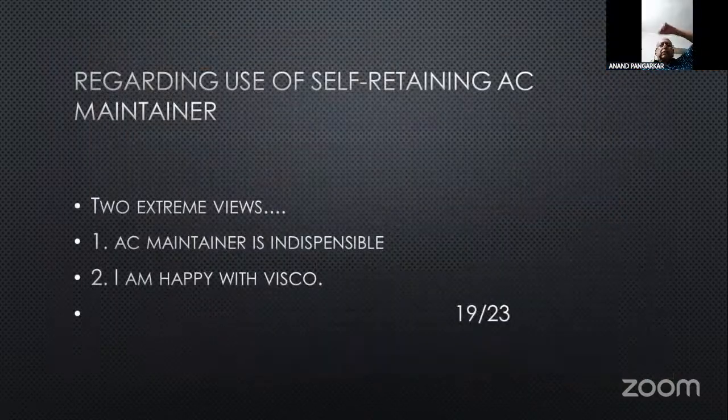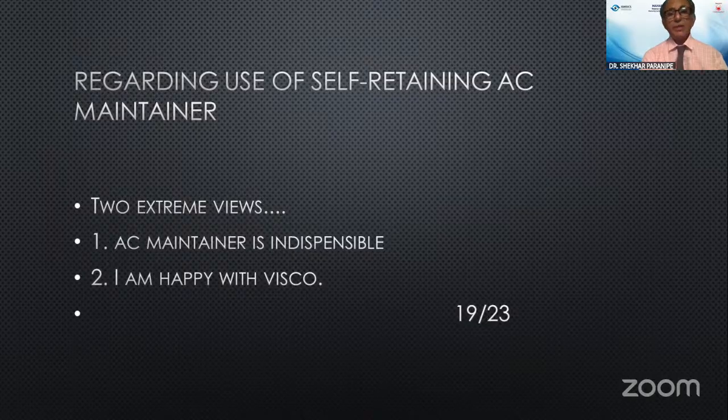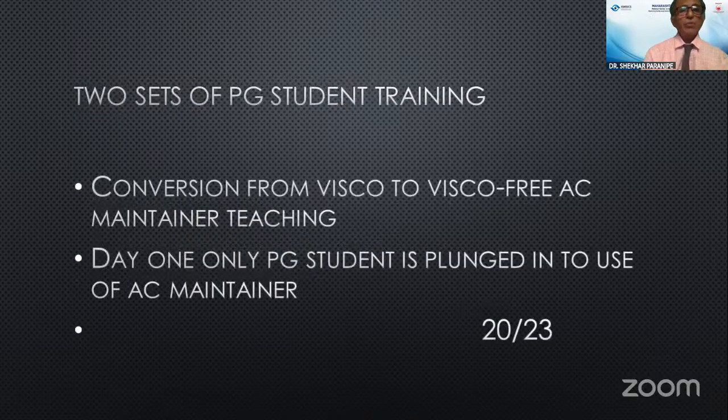On the use of the self-retaining AC maintainer, there are two extremes. One set of surgeons say the AC maintainer is indispensable, while others say I am happy with my visco. It would be very interesting to make arrangements something like this in PG studies also. A group of a few PG students are made to convert from visco to visco-free AC maintainer surgery teaching, while another set of PG students plunge directly into the AC maintainer type of technique. It will be very interesting to observe how they progress.